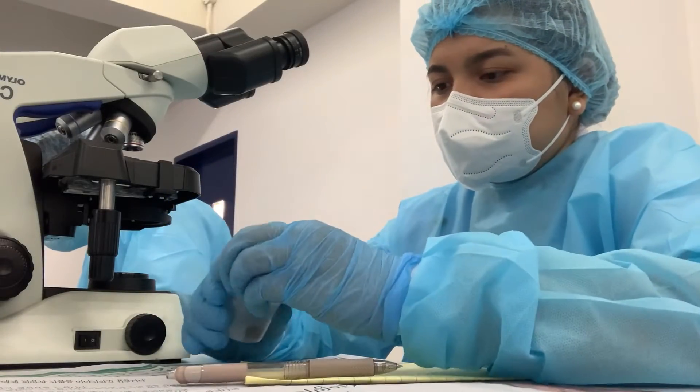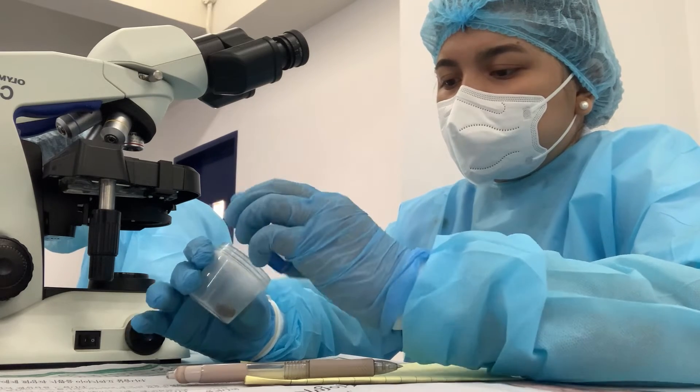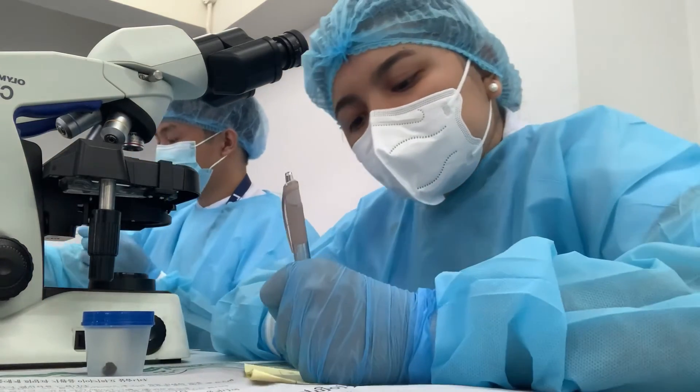For the macroscopic examination, check for the color and consistency of the stool sample. Record your observation.